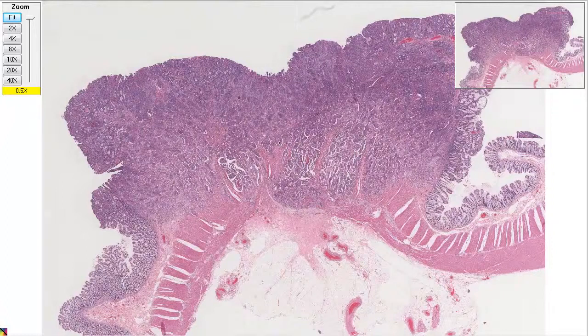This is now the fourth of the slides, and this would be the business for why that segment of colon was removed. This is the colon cancer. Just to orient, we'll go now to the drawing. Up here is the lumen, which is the inside of the colon. Out here is the rest of your belly, where the bowel is all kind of rotating around in the abdomen.